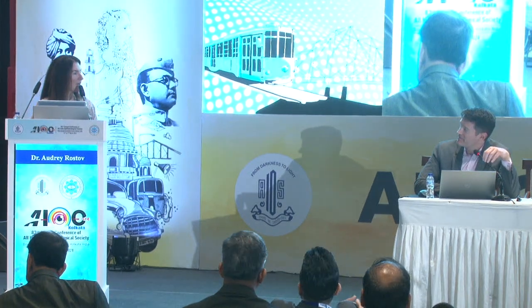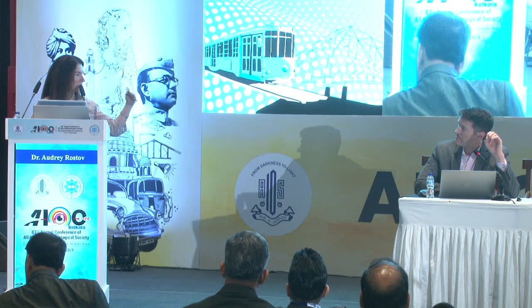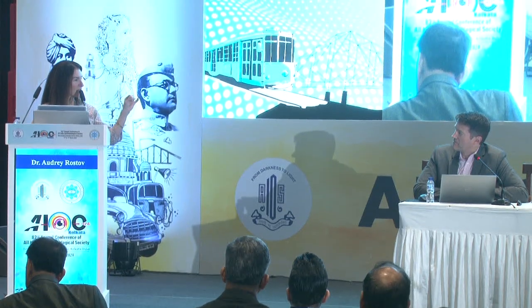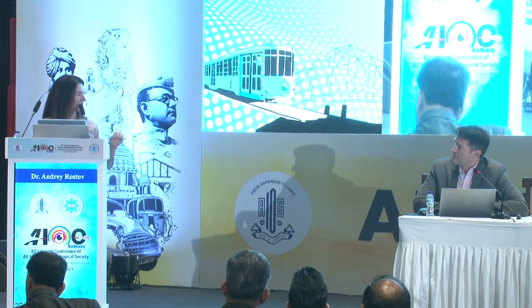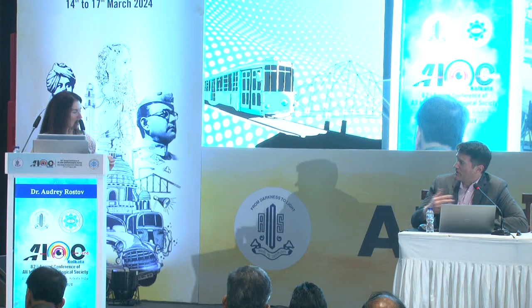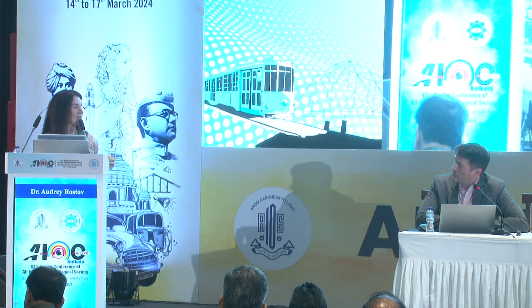I have a question. You mentioned a couple of times avoiding the filter zone, like during implantation. What happens? Why is that? You can damage it, and you can scratch it, and I guess theoretically one of two things. One, you can damage the lens, but also potentially that pigment, you don't want to release that pigment. So it's actually pigment impregnation on the surface of the optic. Correct. Because you mentioned avoid it during the YAG, but then you mentioned also avoid touching it during the implantation, centration, et cetera.